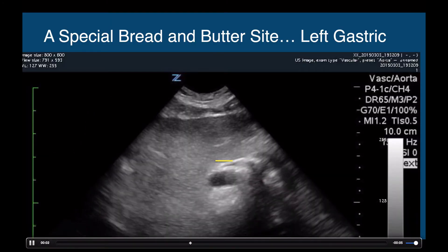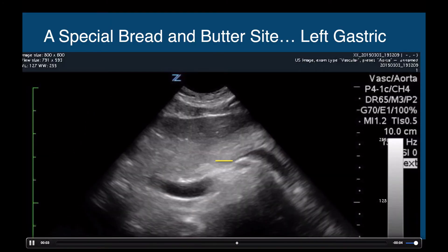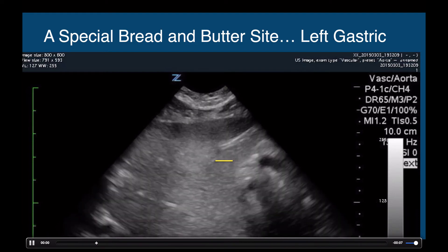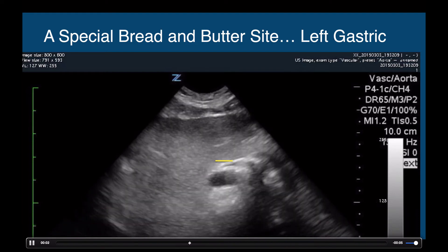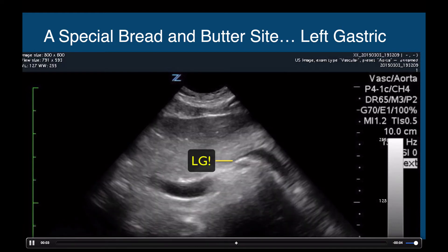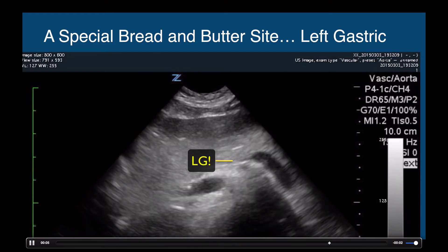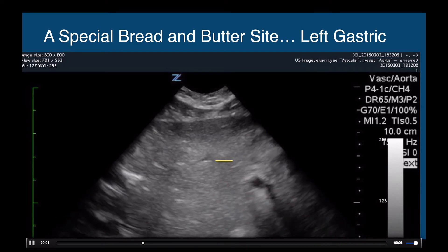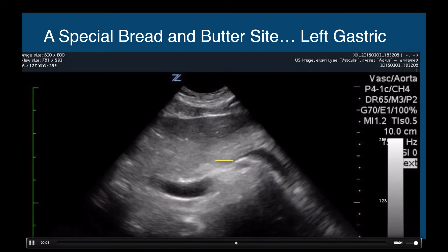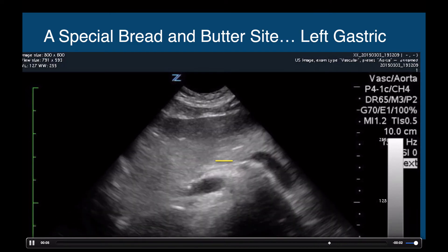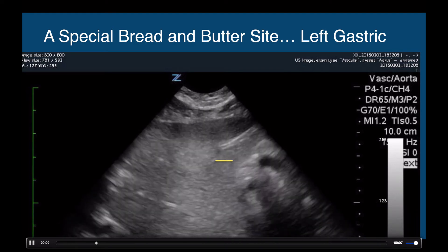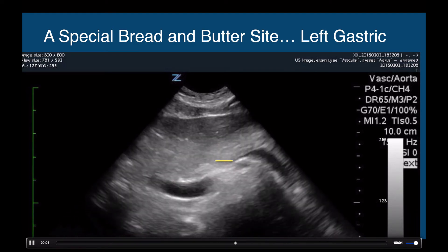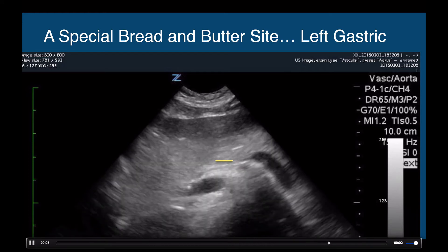Here we get a look at the elusive left gastric artery. We see the common hepatic and the splenic artery, and then we get a hint of the left gastric just as it's going superior. That's a special finding, and I want you all to look for this in your own patients.